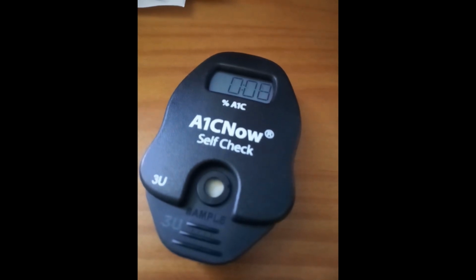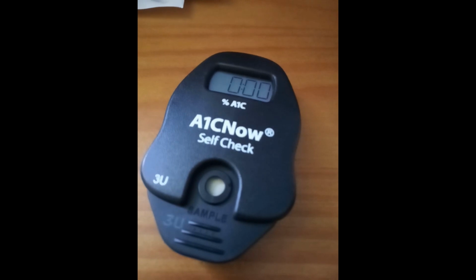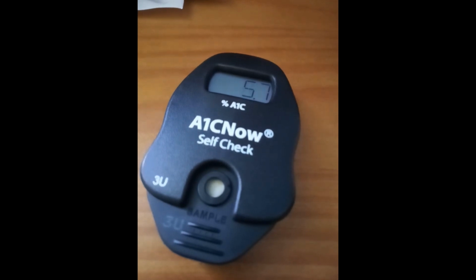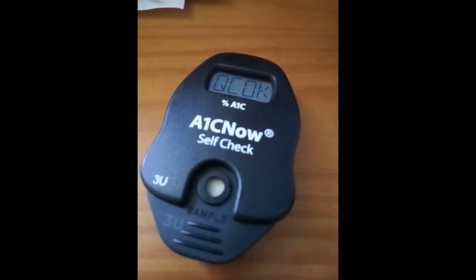9, 8, 7, 6. This is like the moment of truth. Should I be doing more exercise? Quality check's okay, that's what that means. 5.7. Oh dear. That's a bit higher than the last one. The last one I had came out at 4.3.